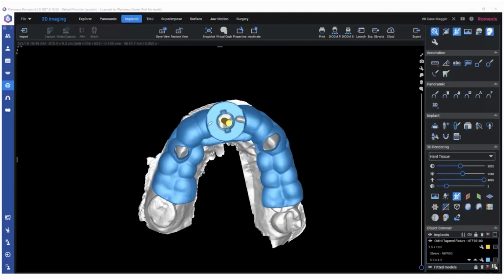I'm not having to kind of go back and check my position. I'm really just doing the case, and not exaggerating, a single unit, easy, flapless case, you're executing in 5 minutes. To the point where I'm doing a lot of these under local, where I used to have sedated these cases. So lots of advantages, I think, for you to adopt a workflow like this.